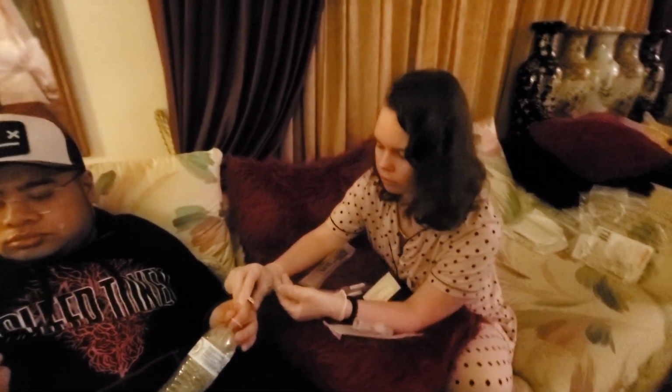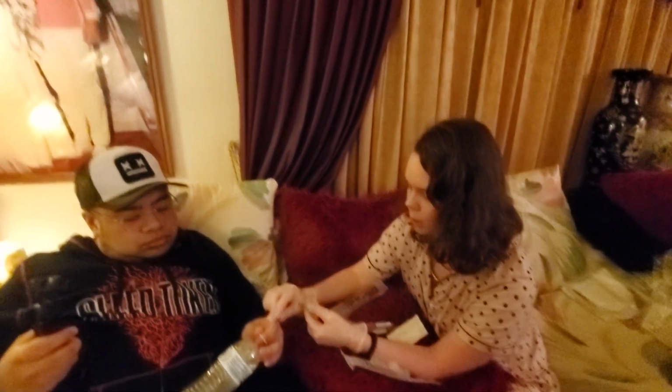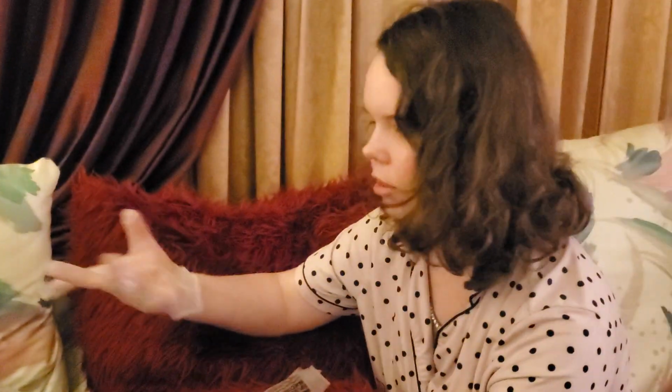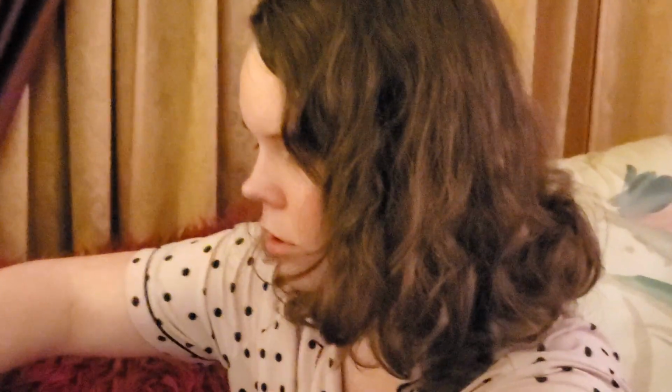Now with the central lines, especially the ones that we use in the lab to practice with, they have positive pressure caps. So technically we don't need to be doing all this clamping and unclamping, but I like to practice with it just in case, because not every place is going to have those caps. Not every place is fancy.